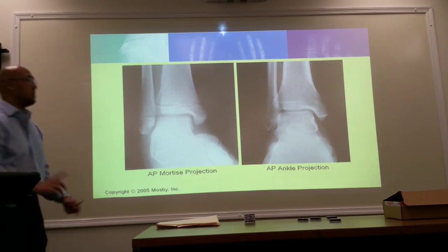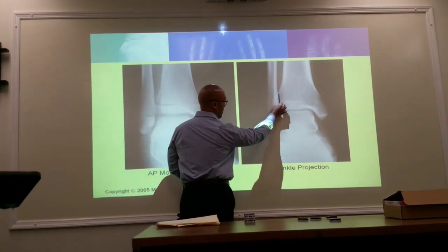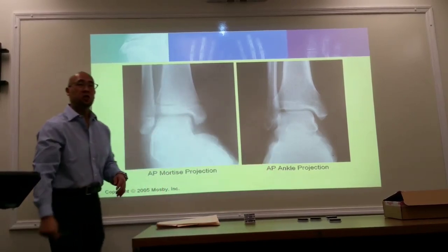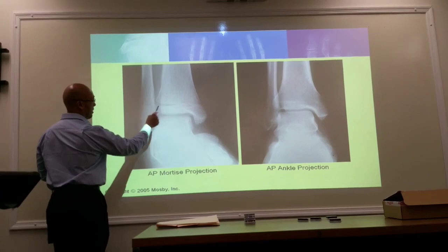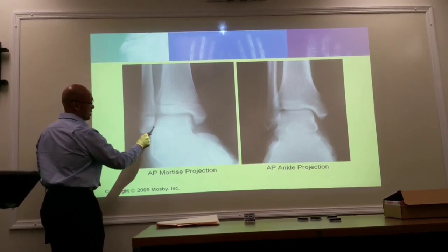But again, make note, true AP, you're going to have superimposition here, and you're going to have superimposition here. 15 to 20 degrees medial rotation now opens up the space between your tibia and fibula, and also opens up the space between your fibula and the talus.